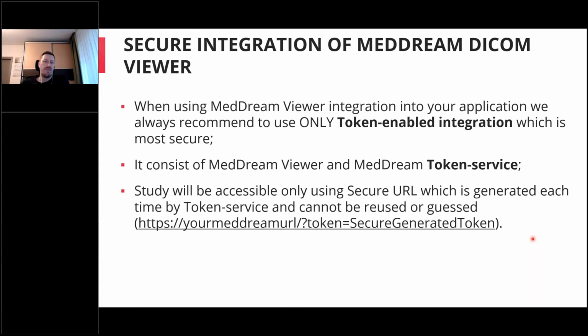But of course, the easier way would be to go with the MedDream token service, which actually comes when you install MedDream or when you download the zip file. So token service will be there. It just won't be installed, but it is a pretty straightforward installation.